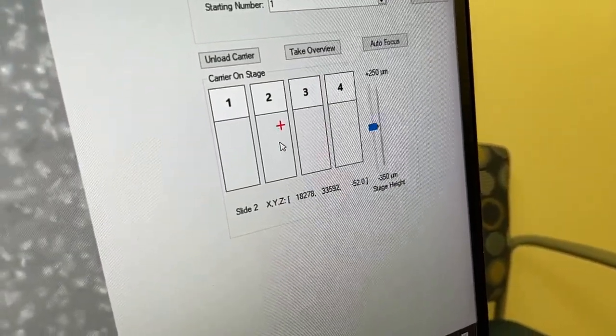Like, oh, maybe it's over here. Who wants an iPhone interface with a mouse and a monitor, and just grab the image and fling it somewhere? That sucks. Okay, I think this is the anterior commissure, and then that's the midline.